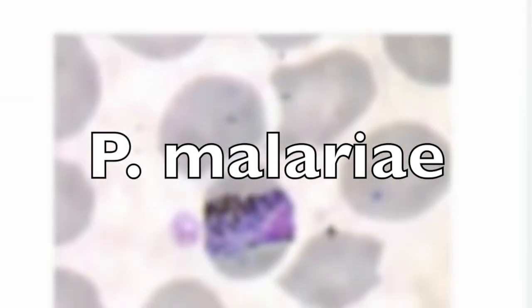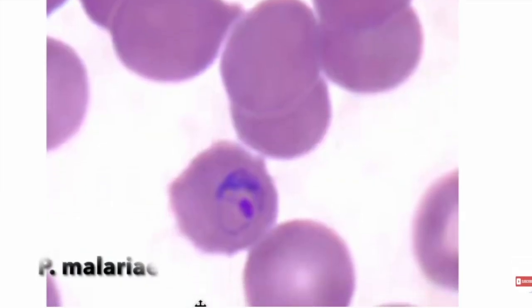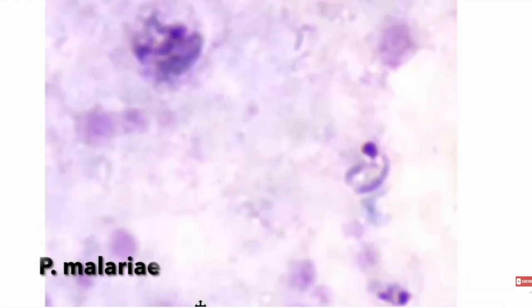In this video, we're going to look at Plasmodium malariae. Yes, it also causes malaria, and everyone talks about Plasmodium falciparum, and honestly, I understand why. It's the malaria parasite we hear about the most. It causes severe disease, it can reach very high parasitemia densities, and when you look at a blood film, it has some pretty distinctive features.